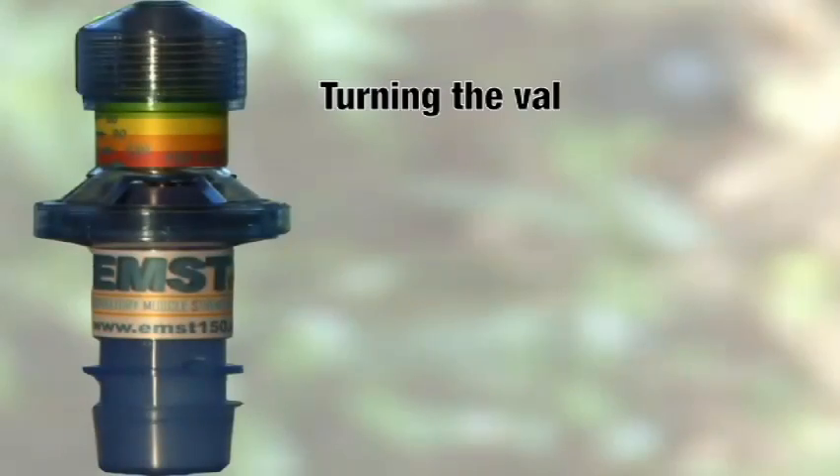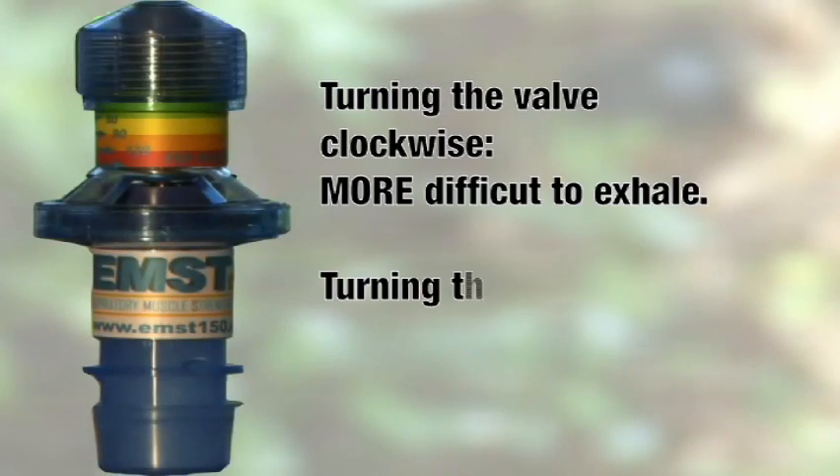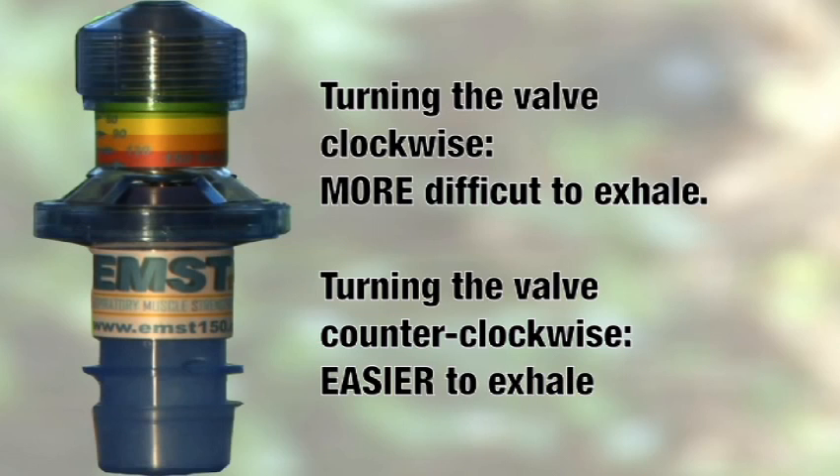Once you've unpacked your trainer, the first step is to adjust the spring to the proper tension for you. Turning the valve clockwise makes it more difficult to exhale, while turning the valve counterclockwise makes it easier. To begin, uncap the EMST 150 and insert the mouthpiece into the EMST 150.